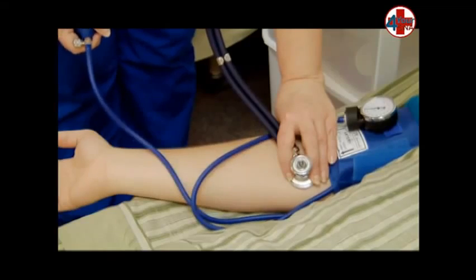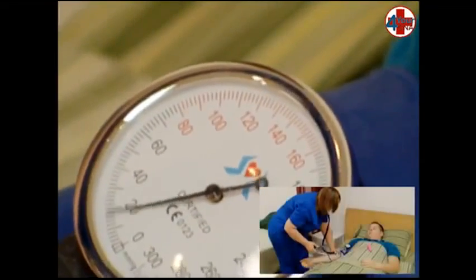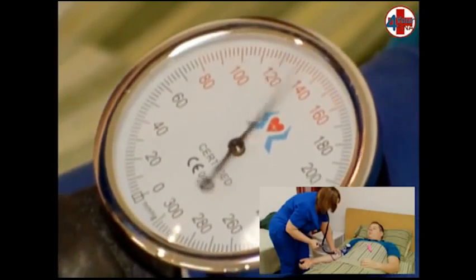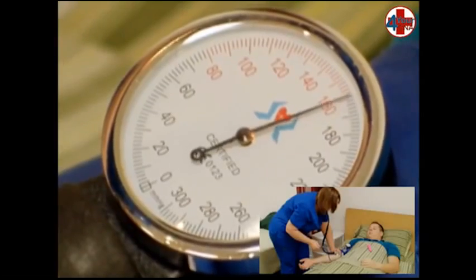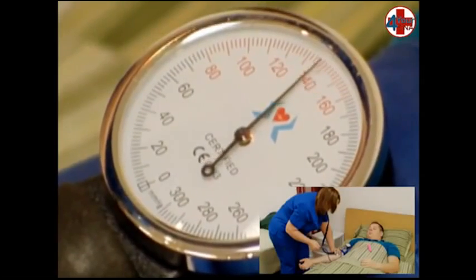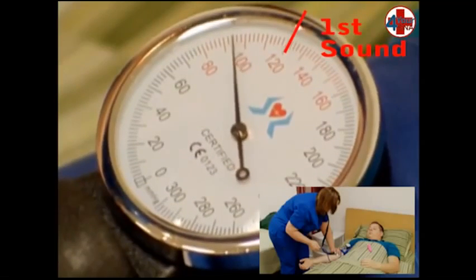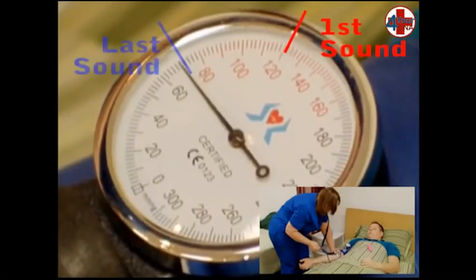Hold the bulb assembly in your dominant hand, turn the valve to the right to close it, and inflate it to 180. Open the valve slightly to the left to let air out so that the needle descends at a nice controlled rate. Listen for the first and last Korotkoff sounds. The needle may bounce with each heartbeat, but we record what we hear, not what we see.